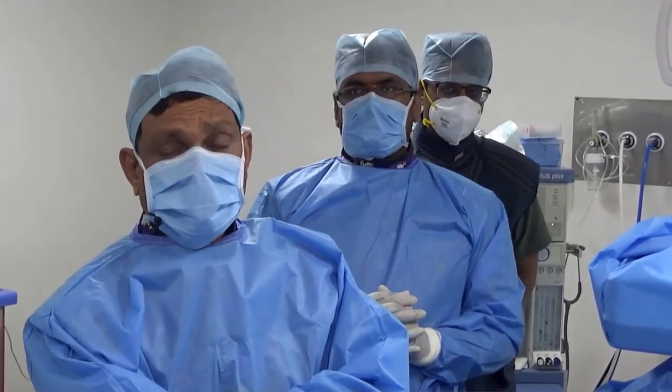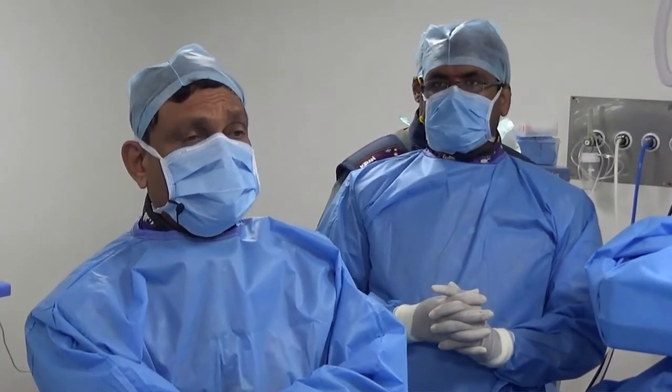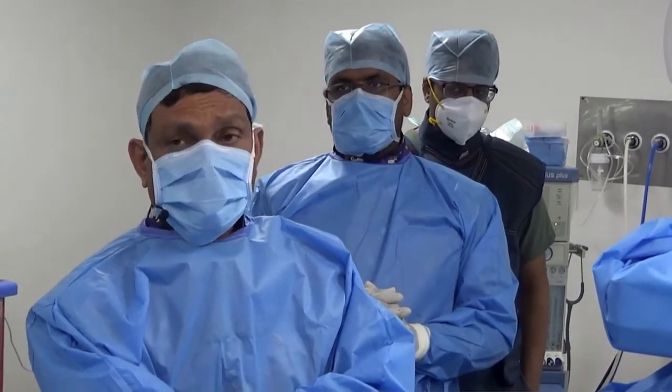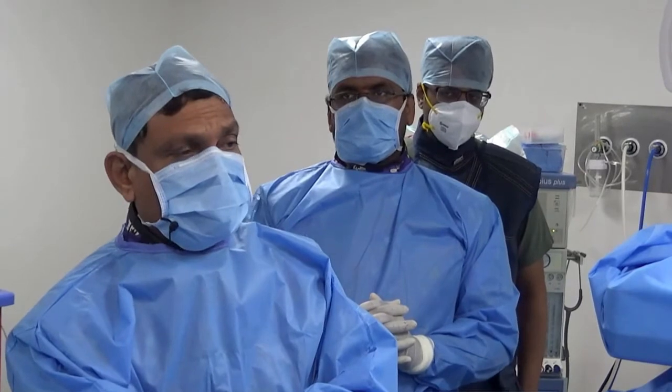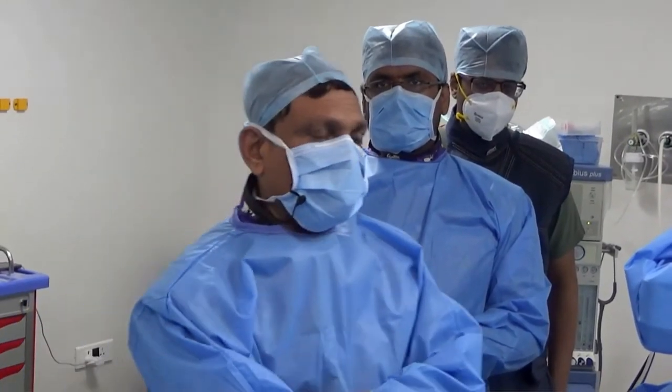We have also experienced one case a long time back at a care hospital closing a LAD fistula. We had to give intracoronary urokinase as well. That's a very valid point, because this fistula is a distal fistula and the entire circumflex is uniformly dilated and ectatic.